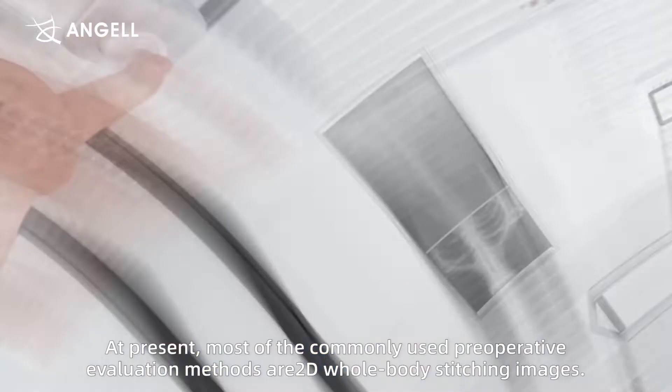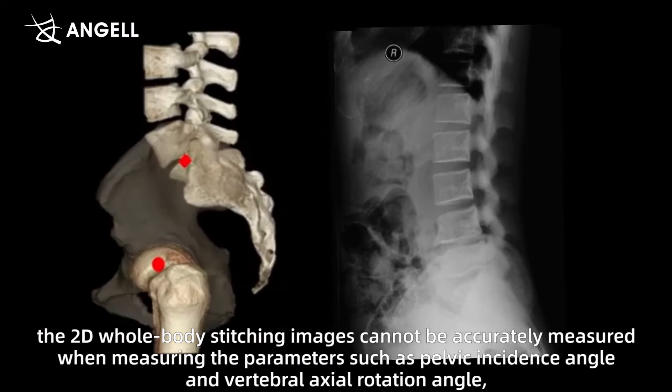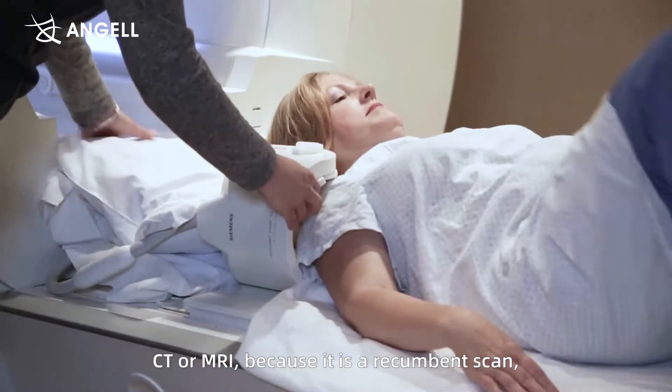At present, most of the commonly used preoperative evaluation methods are whole body stitching images. However, due to the tissue overlap and parallax of 2D images, the 2D whole body stitching images cannot be accurately measured when measuring parameters such as pelvic incidence angle and vertebral axial rotation angle, which can easily cause misdiagnosis.